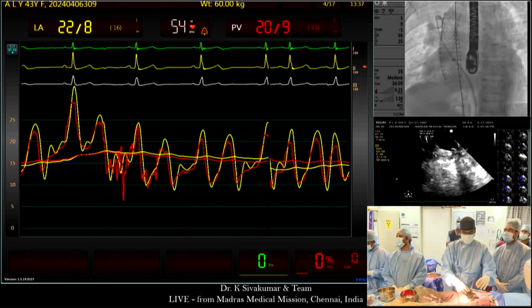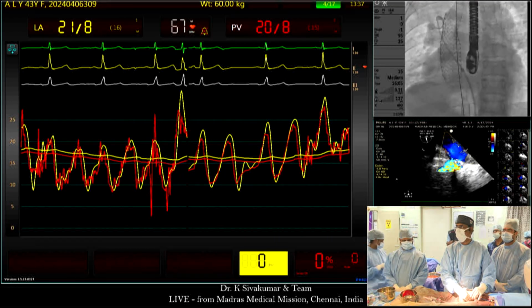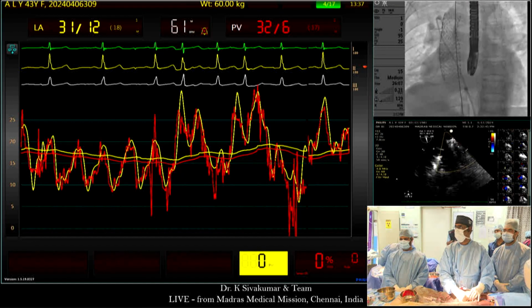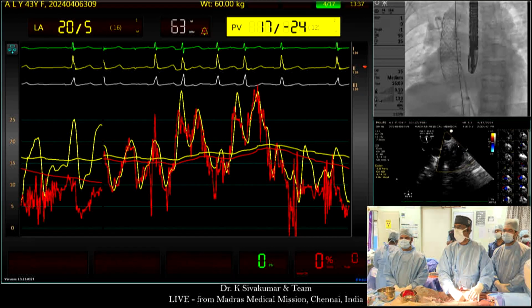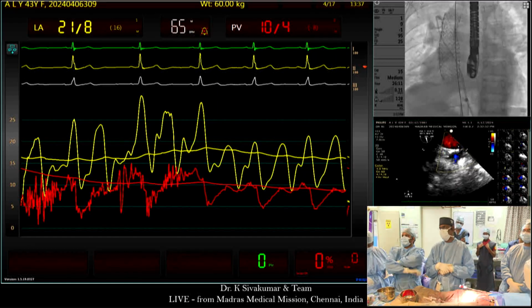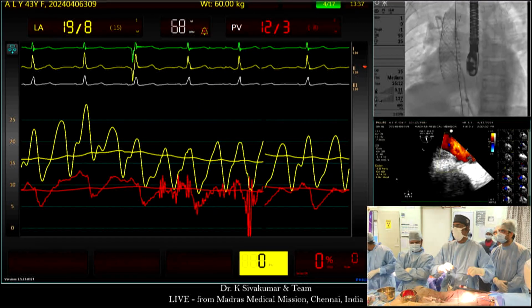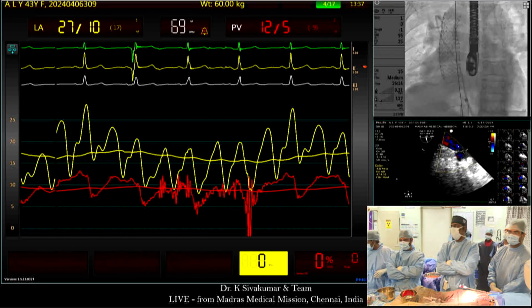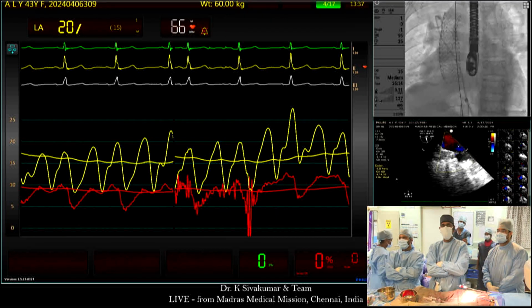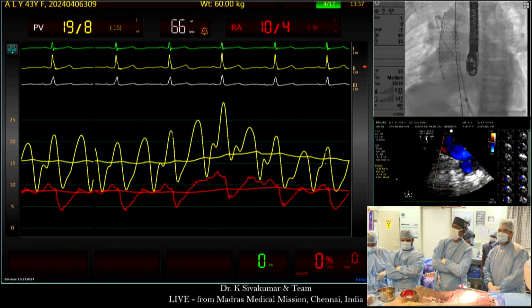We have a question from Gregor. Go ahead. I belong to a center which would do this surgically, honestly, and I'm looking forward to learning more on Friday. Having said this, in the more than 300 cases which you mentioned earlier, is there any sinus nodal problem? Is there any thrombus problem? And what we discussed now, the diaphragm: are there patients with phrenic nerve paresis? Could you comment?